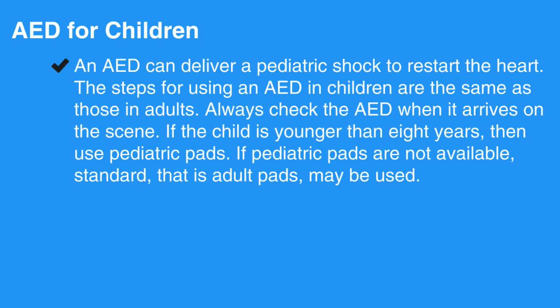An AED can deliver a pediatric shock to restart the heart. The steps for using an AED in children are the same as those in adults. Always check the AED when it arrives on the scene.